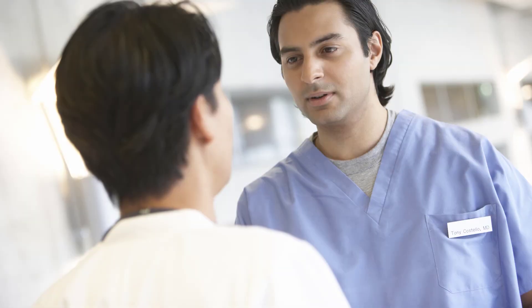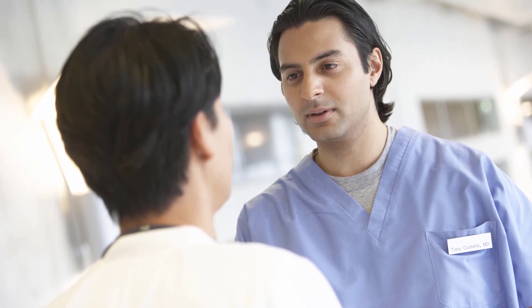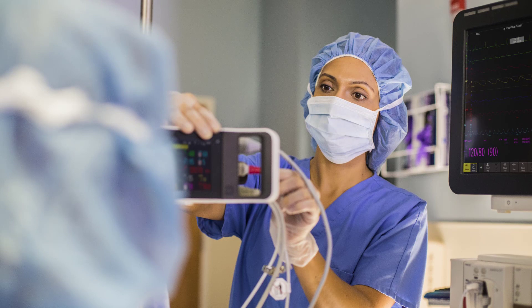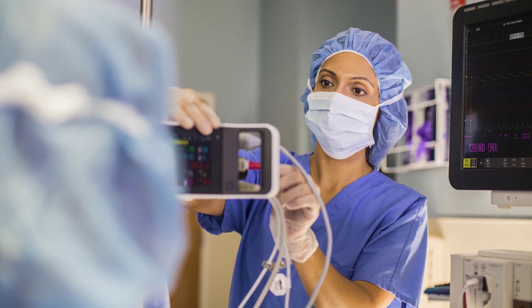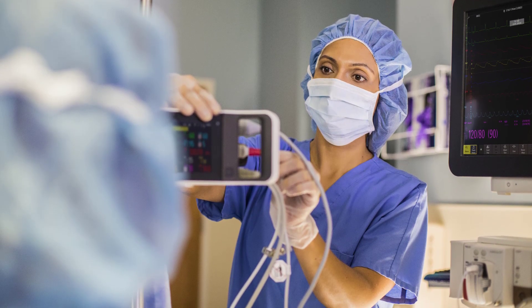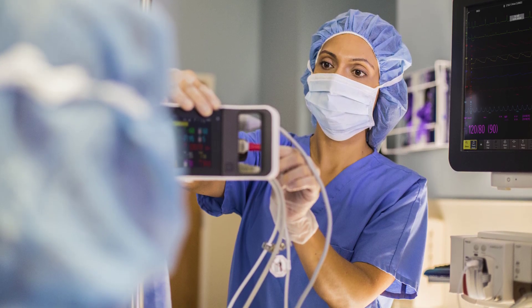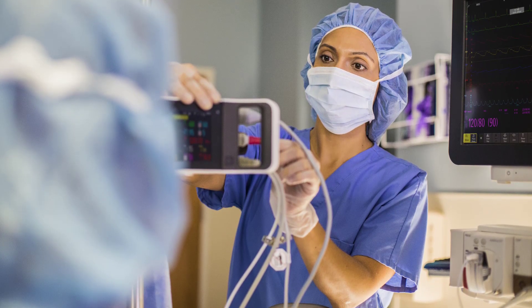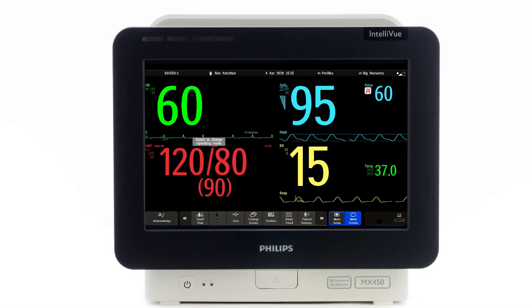Contact your local Philips representative for additional support on how to find, set up and use these features in your monitor. When connecting your patient to the monitor, strive for a first-time right approach. Take the time to connect sensors and cables correctly to your patient. This way you avoid re-entering the room to reconnect a measurement cable or sensor, which will save you time and reduce the risk of contamination.